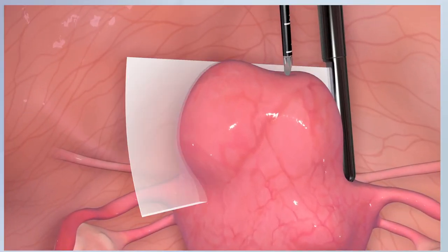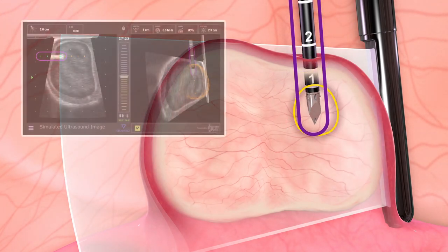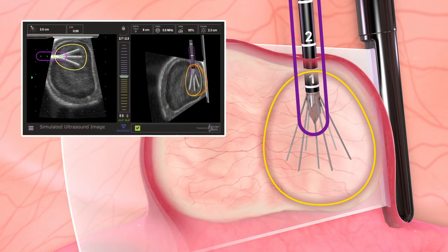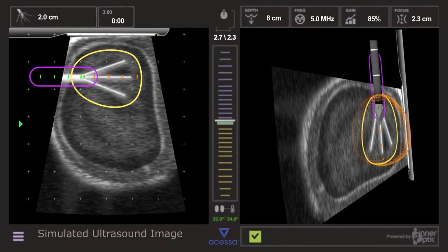Under ultrasound guidance, the Acessa handpiece is inserted into the fibroid and the seven thin needle-like electrode arrays are deployed into the fibroid tissue. The guidance system overlays the ultrasound image with the projected path of the handpiece.